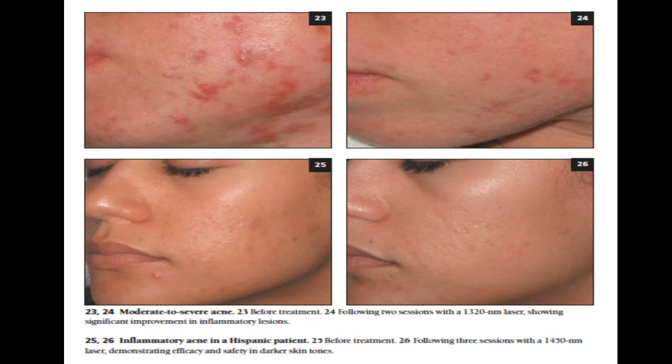Pre-, intra-, and post-pulse epidermal cooling is achieved with 3 pulses of a cryogen spray. It should, however, be noted that cryogen may in turn cause cold injury to the epidermis, leading to post-inflammatory hyperpigmentation in darkly pigmented individuals. Cryogen delivery time should, therefore, be shortened in such cases.